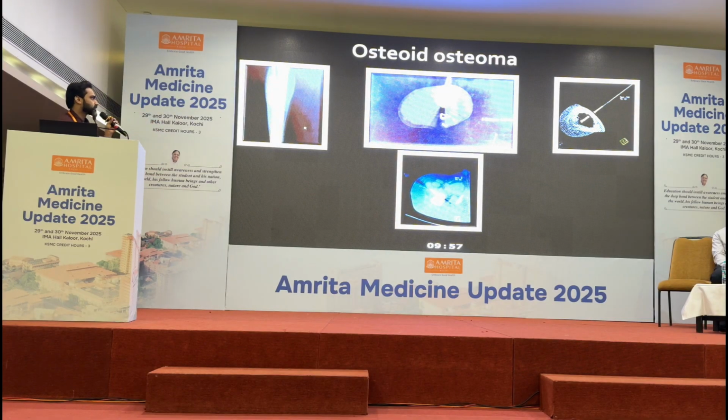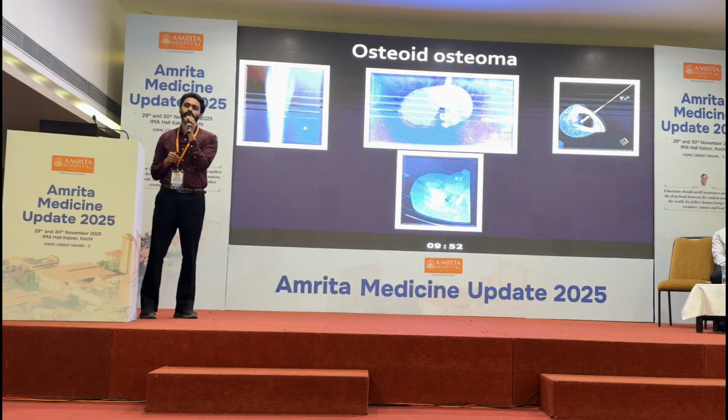This is an image which shows ablation of a bony lesion. The most common bone lesion which we ablate is osteoid osteoma.